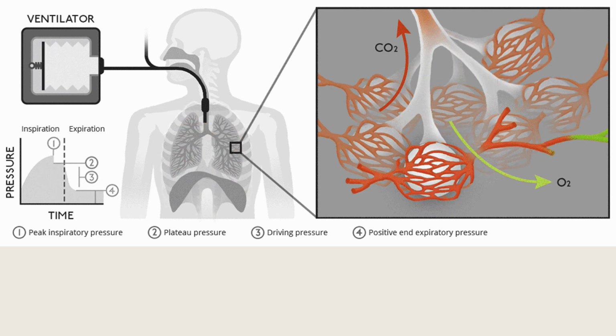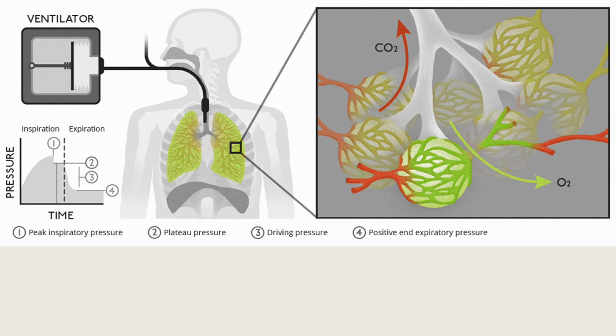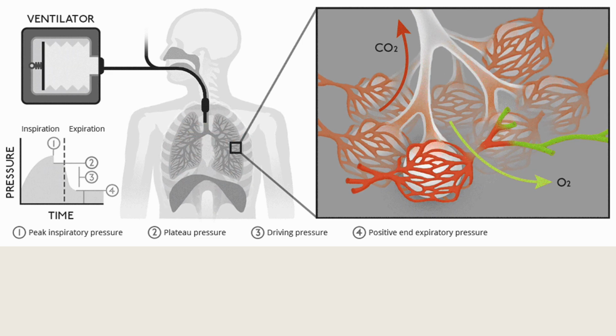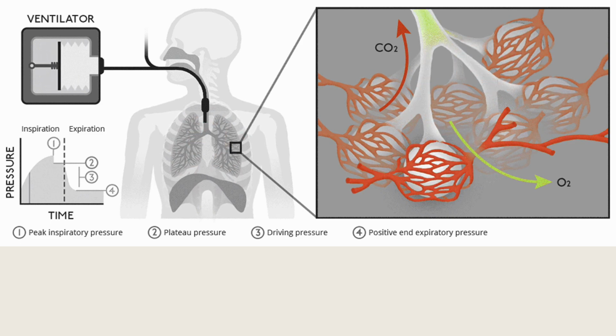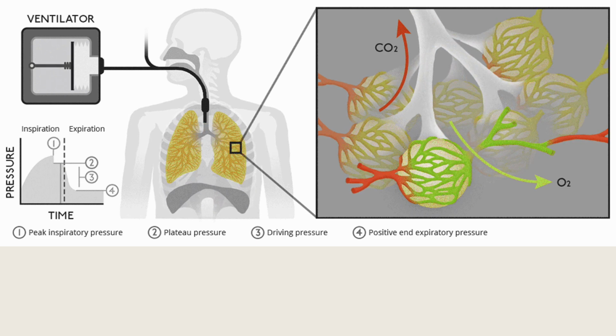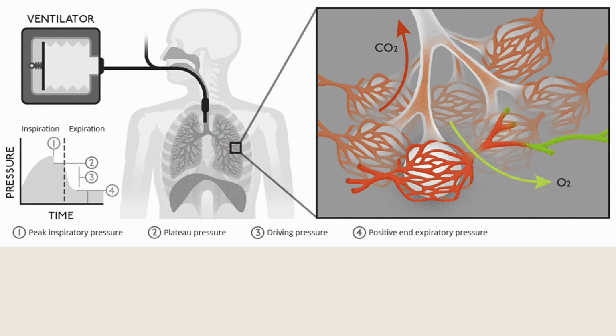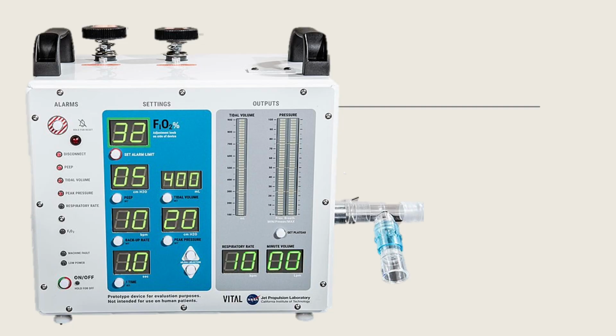Now, this is how a ventilator works: it does the job of pushing in oxygen at a certain pressure, pushing the alveoli open with oxygen to allow gas exchange, and CO2 diffuses out anyway. So every part of this process has a different setting. How much oxygen are we gonna add? How much pressure to open up these stiff alveoli that do not have surfactant, at what rate, and with what volume? So this is the typical ventilator.